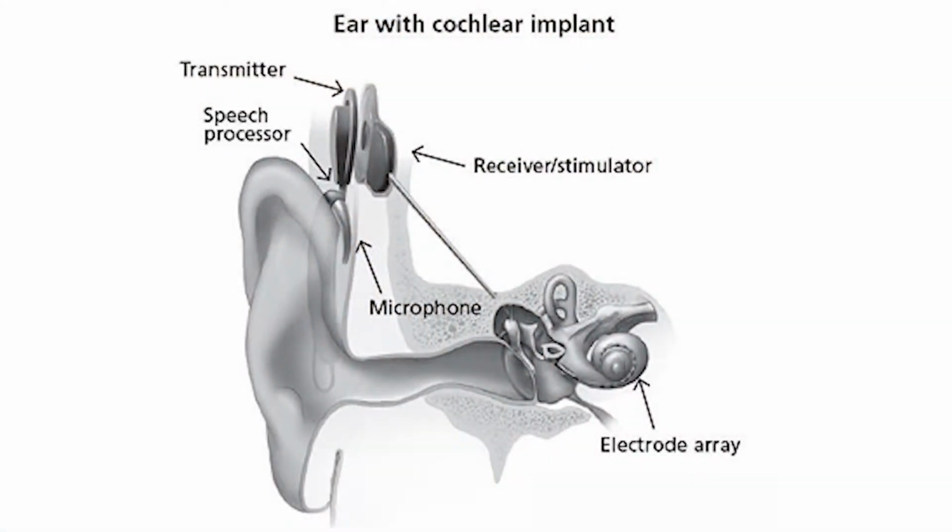Hello everybody, my name is Dr. Sampath Chandra Prasad Rao. I am a trained skull-based surgeon and a cochlear implant surgeon. Cochlear implantation is a very special technology that brings back hearing to potentially deaf people, what we call sensorineural deaf people.